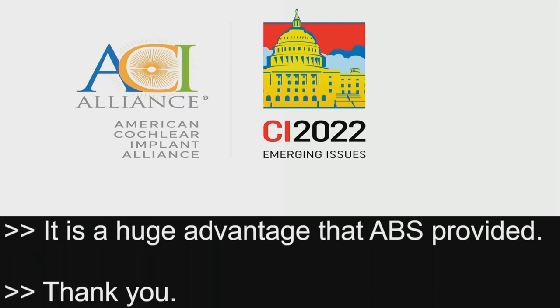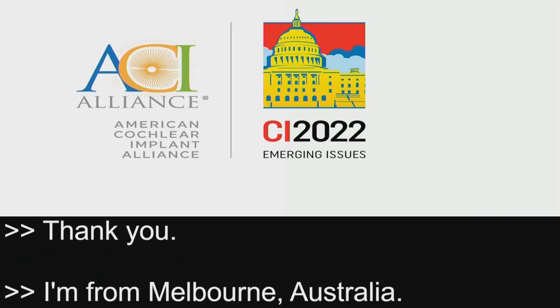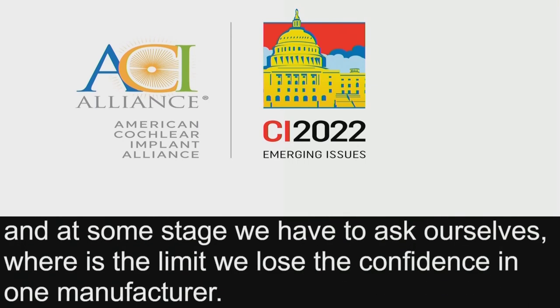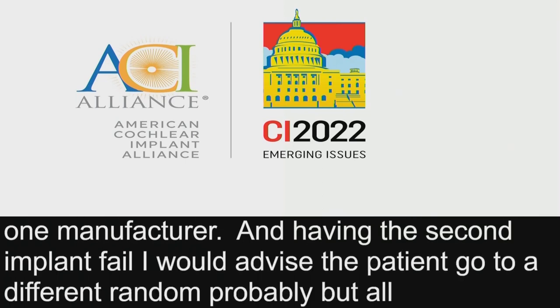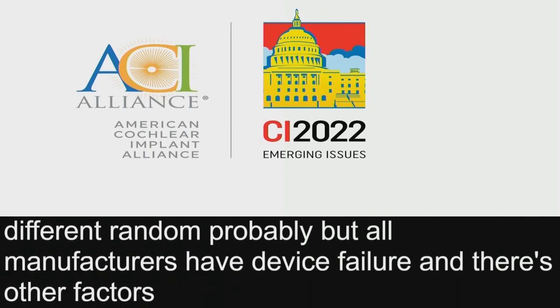Hello, Marcus Dam from Melbourne, Australia. I think the reality is that we've got more and more failures, and at some stage we have to ask ourselves, where is the limit when we lose the confidence in one manufacturer? For me, if the second of the same implant would fail, I would probably advise the patient to go for a different brand. But the fact is, all manufacturers had device failure, and there are other factors like elective surgery, like you mentioned, Tom, that people choose to have a better processor and things done for this. So we will have more numbers.